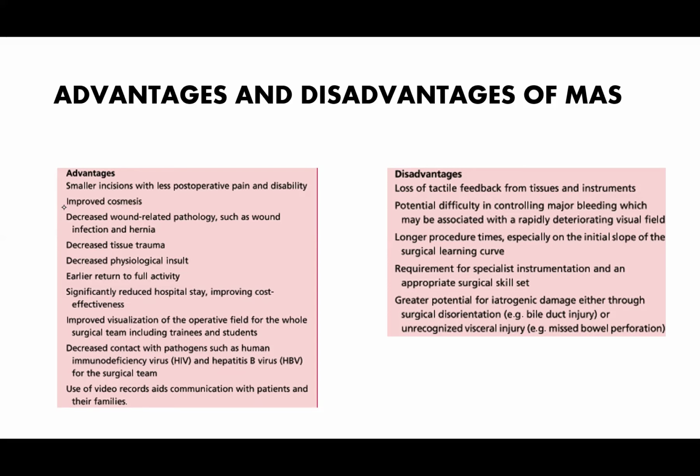Most of our patients that come for minimal invasive surgery, you'll see them providing their phones for the procedures to be recorded so that they will have a detail of the intra-operative findings. But of course, if you have devices that are designated for all these recordings, they can even be edited and only the relevant parts of the procedures are provided for the patient.